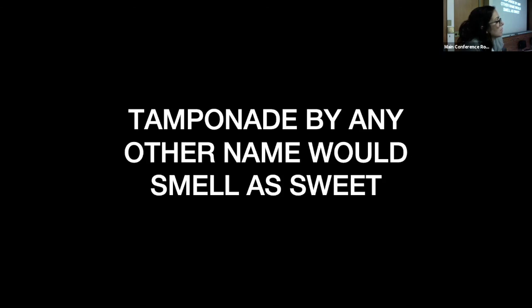Yeah, we're starting to get literature about the cases that are missed. Those are cases where something else masquerades, which is much more common. Like a patient with rapid AFib comes in, you find diastolic collapse, and people are not thinking, let's do the echo, let's look for a different cause for why it's going up, why I can't control the heart rate. Some of the other papers are talking about cardiologists being astounded at how often we catch this on CAT scan. Kind of like the case you just brought up. If we're looking for PE, somebody finds the fluid, as opposed to if you found it seconds after you met them, you'd catch that much earlier.